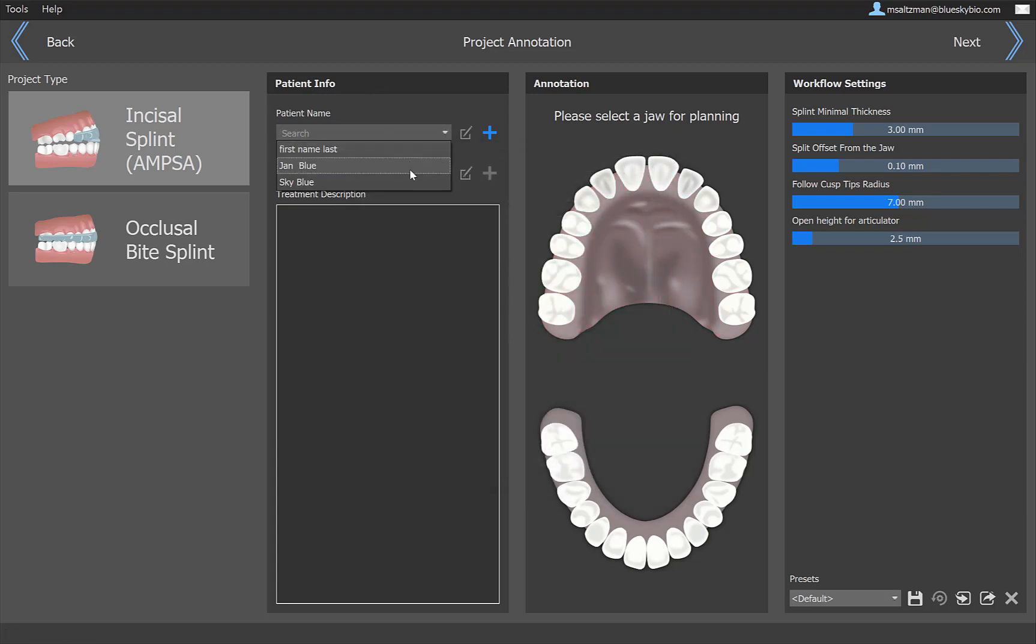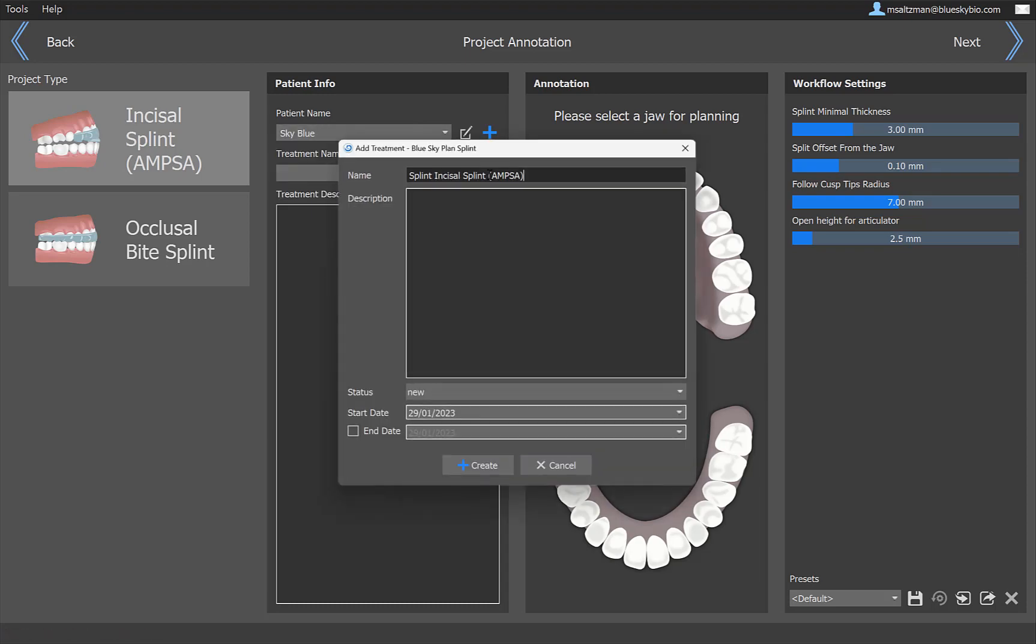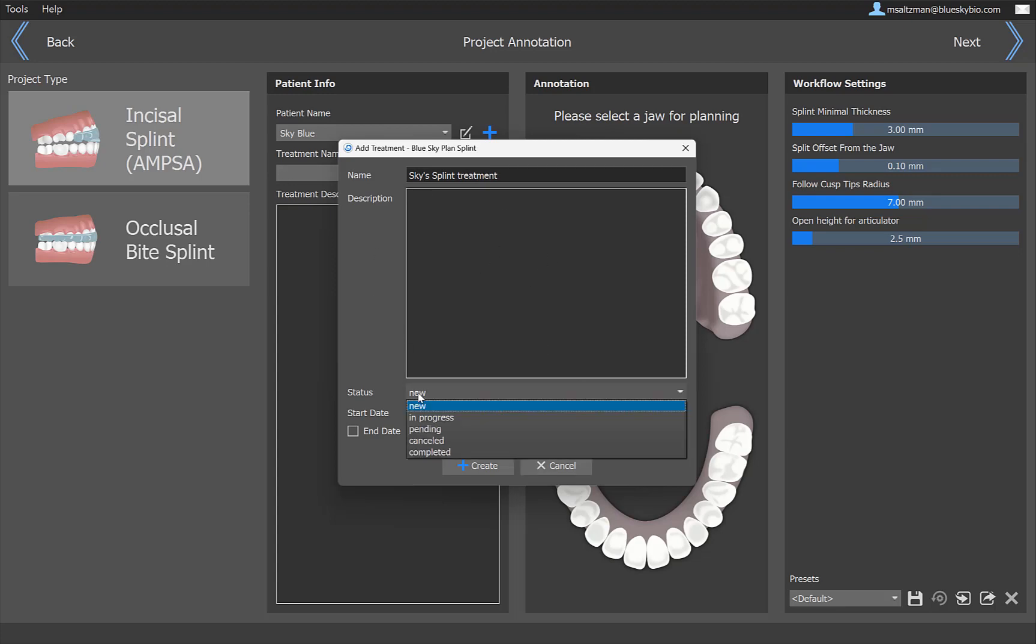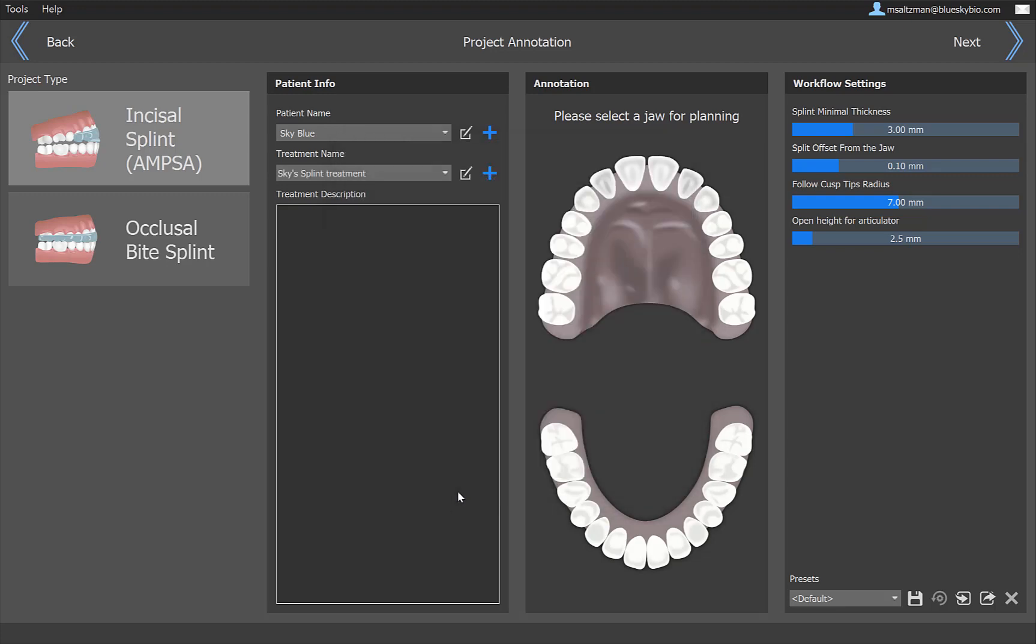We're going to go ahead and choose our favorite patient, Sky Blue. Treatment name, let's go ahead and just create a new one. By default, we populate it with the process flow, and we'll call this Sky's Splint Treatment. We can put in any description or notes that we want. Status, of course, obviously is new. Start date is now, and end date we can put in if we want. We're going to click on create. Now we're good to go with our patient and our treatment.